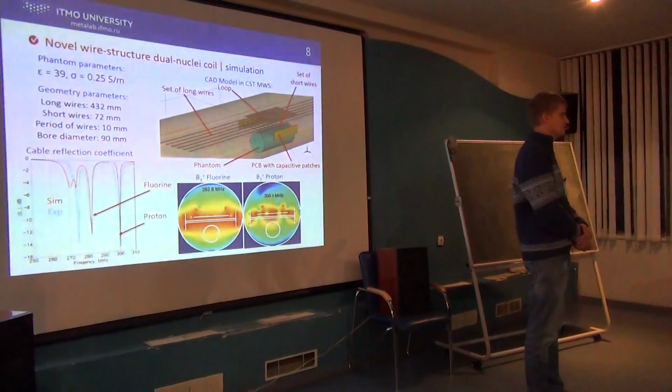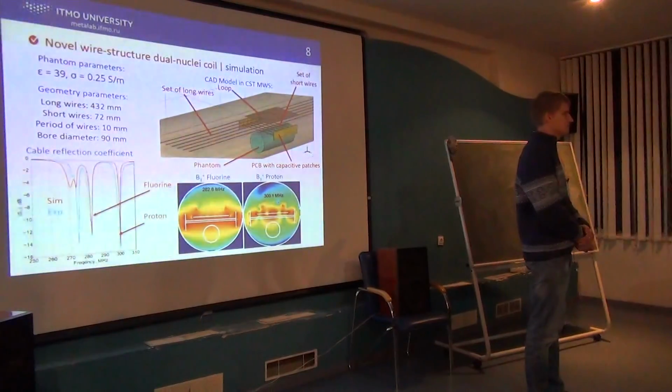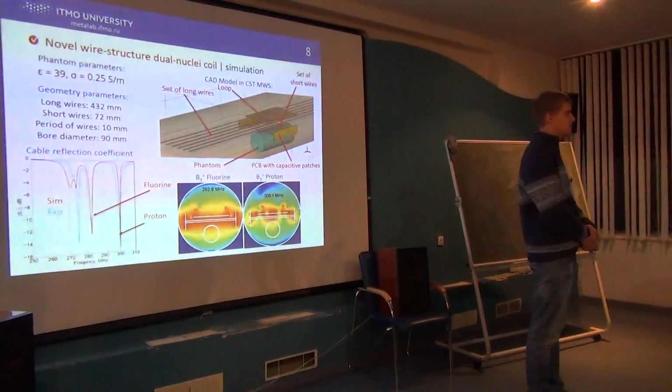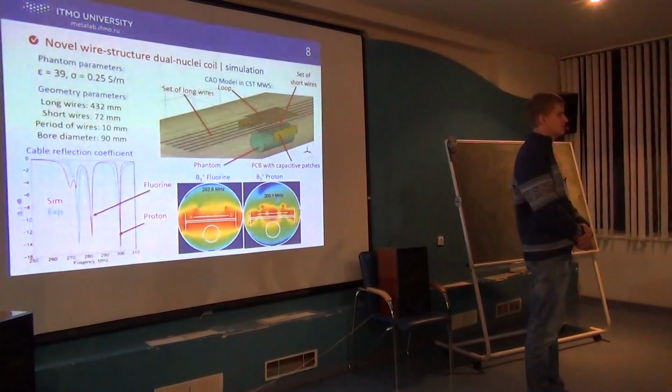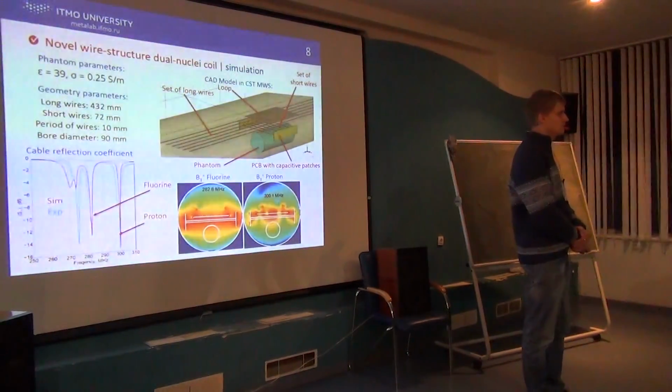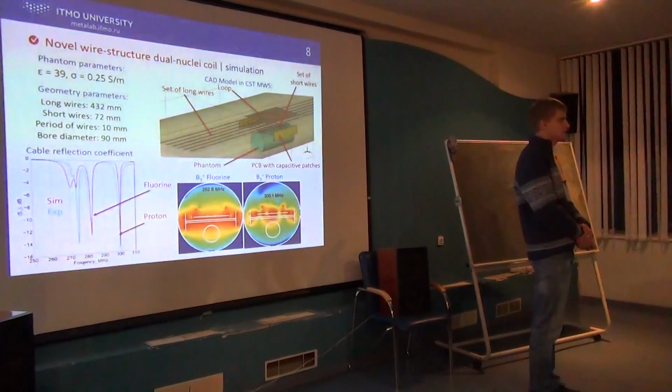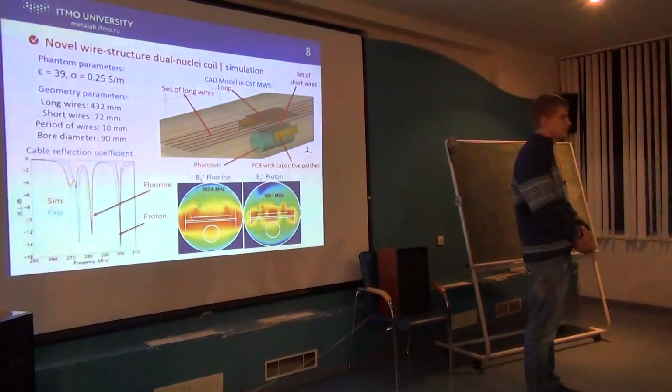Thank you for this nice idea. My question is the following. You are using the system for the preclinical machine. It means you have a relatively small internal diameter. What about the application of these ideas to a real imaging system like a 9 Tesla machine? And the second part of the question, I understand that this is valid in a certain frequency range. What about increasing the frequency to go to a very high field?